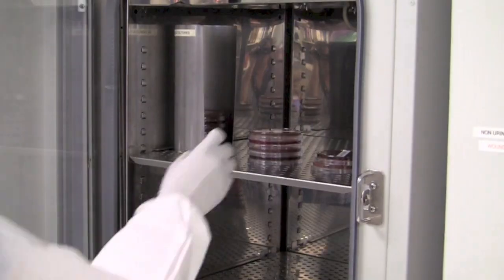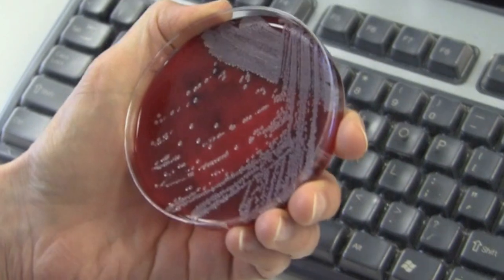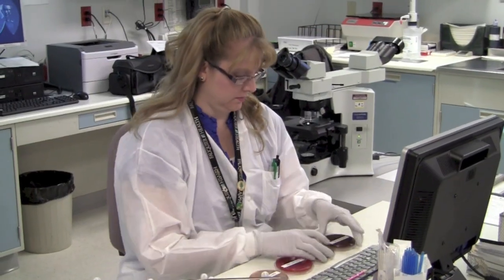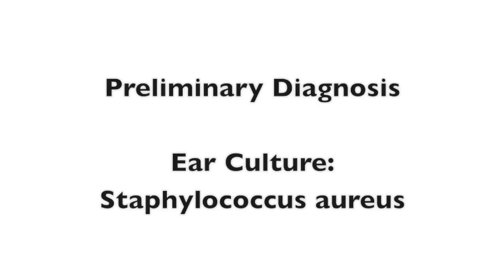The next day, the ear culture and blood culture agar plates which have been placed in the incubator are removed and carefully examined by a microbiologist. By seeing within which plates growth has occurred, identification of the infecting organism can be made and reported. For the ear culture, a diagnosis of Staphylococcus aureus is made.